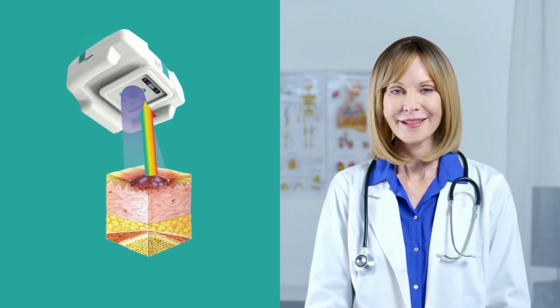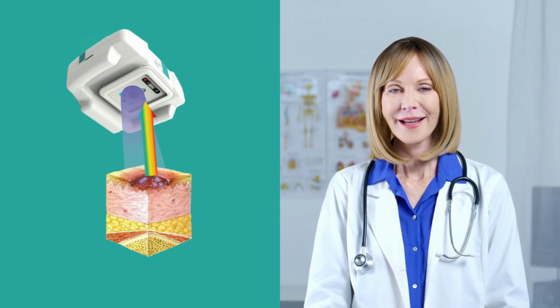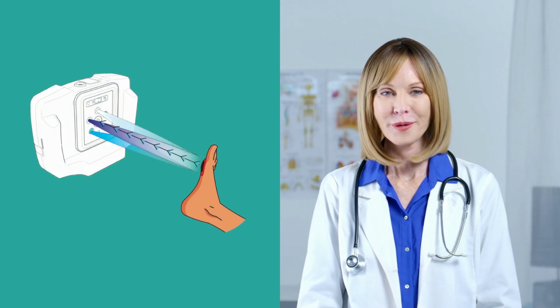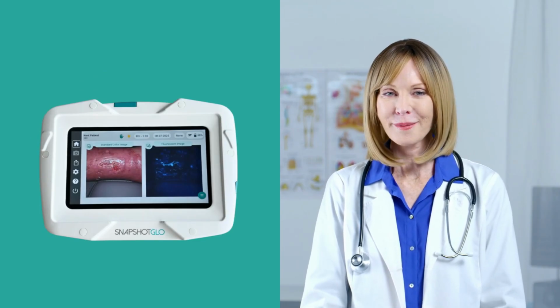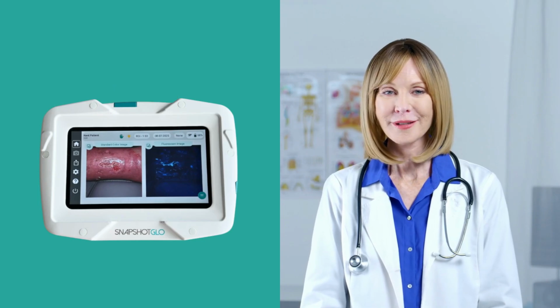It's a portable handheld device that uses autofluorescence imaging technology. Bacteria naturally fluoresce when excited by ultraviolet light. The device projects light on the wound and then captures the emitted visible light to generate images highlighting potential bacterial presence. In a single capture, SnapshotGLO takes a color image and a bacterial fluorescent image shown on the touchscreen side by side.